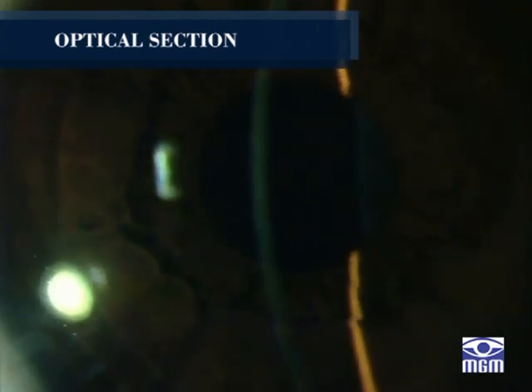The sharply focused light is completely confined to the optic section, thus reducing the scatter and maximizing contrast between the illuminated section and the dark, unilluminated surroundings. Thus, a clear, uncompromised view of the tissue within the beam is formed.